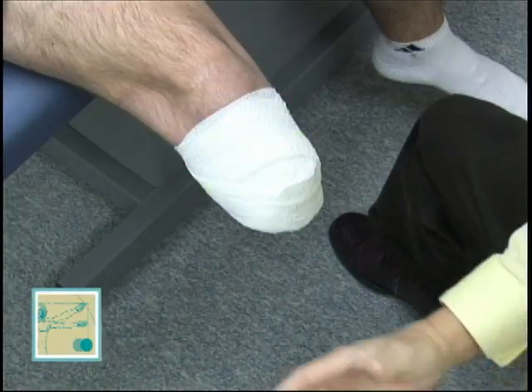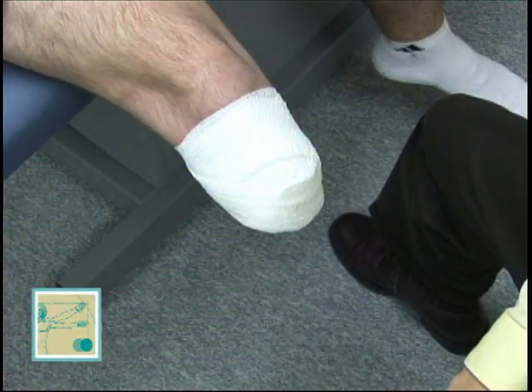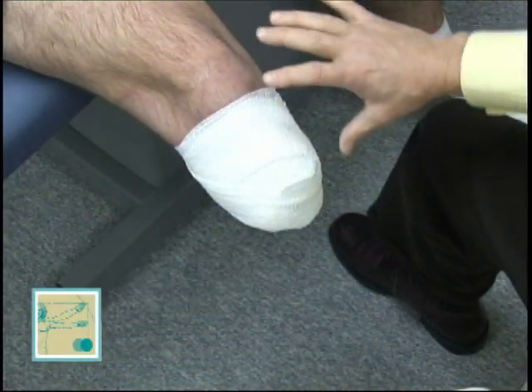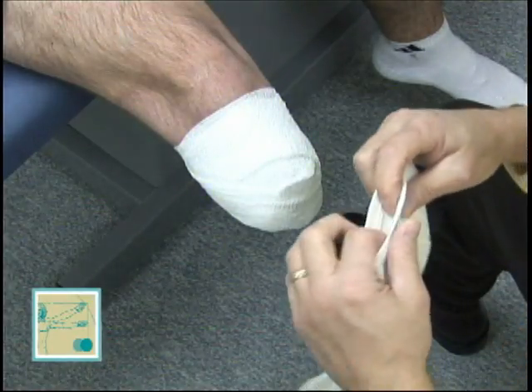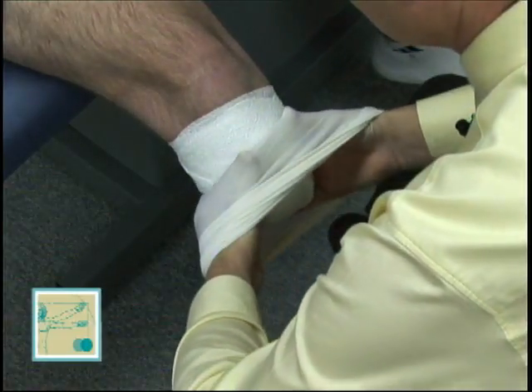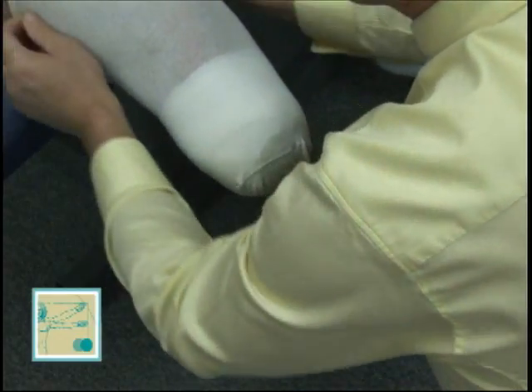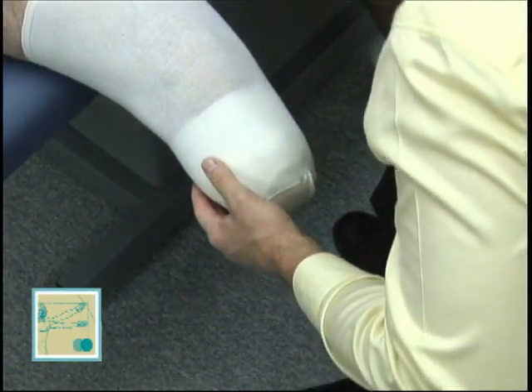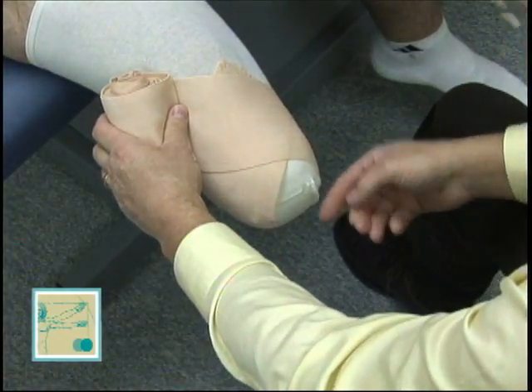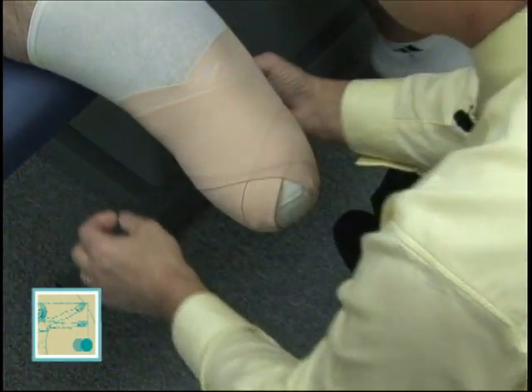What I'd like to demonstrate is that most of the time when you're doing these ACE wrap techniques, you're not doing it on a well-heeled, well-vascularized limb. You're doing it on a post-op limb, maybe day two or three. That limb is very sensitive — it's going to have a surgical dressing on it, sometimes very bulky, sometimes small. So how are you going to ACE wrap that limb and keep that surgical dressing in place? One way is to take a normal one-ply sock, get your hands on the inside of it, and gently pull it up on the limb like this. That one-ply sock isn't offering any compression at all, but it's holding the dressing in place. Now you can go back with your ACE wrap and wrap it better. The ACE wrap is going to stay in place; you're not going to dislodge that post-operative dressing, and the nurses aren't going to be calling you every two hours to re-wrap the limb.